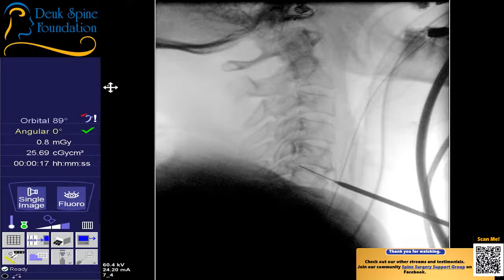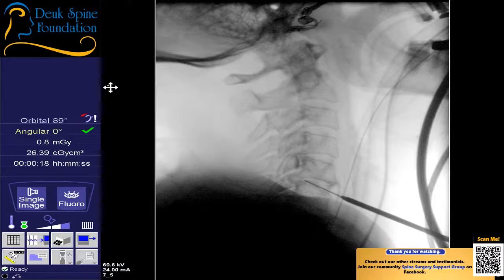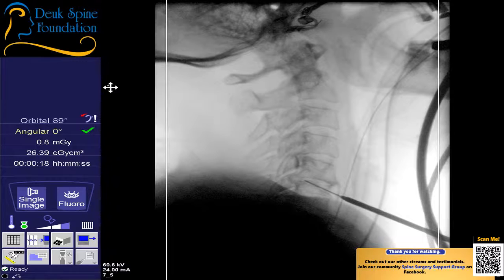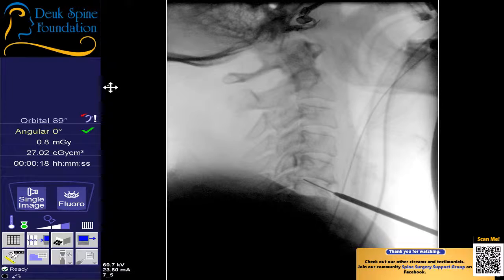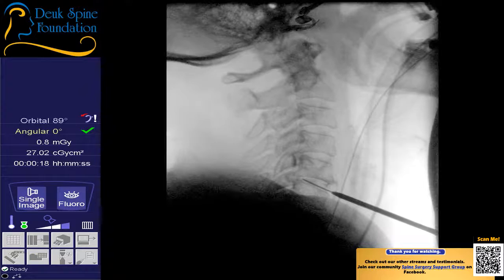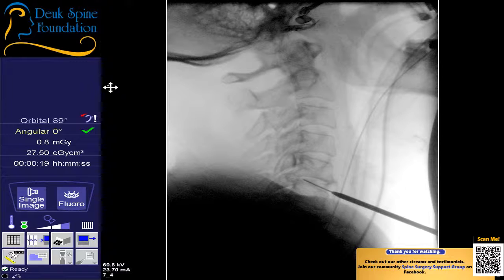Any questions from our audience so far? No questions yet. It looks like we need to wag just a little bit on your lateral view. So I'm almost to the spine with the dilator. The dilator just spreads the soft tissues gently open. We're just about on the anterior longitudinal ligament — I can feel it right now. I can feel the front of the spine. I know I'm as far in as I need to go for right now. I want to verify my position on an AP x-ray.